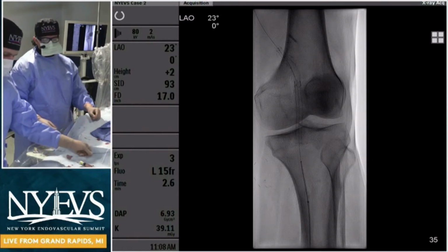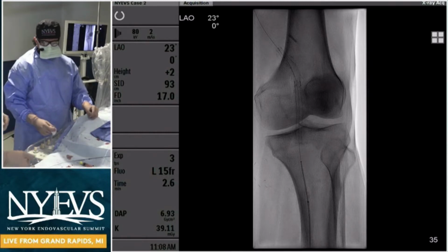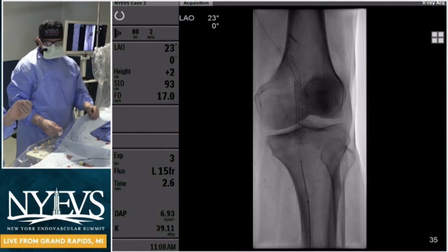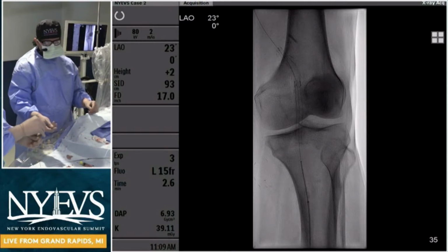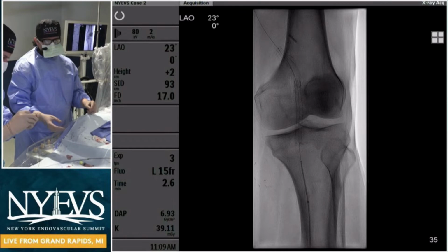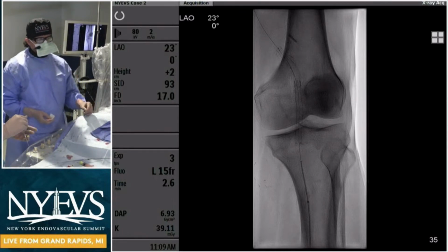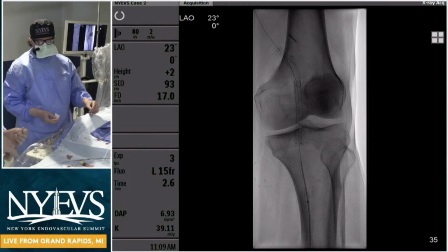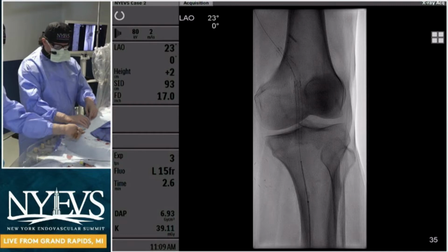Take the fifth, right? But when I was training, we were always taught that once a bypass graft is done, before I intervene on it, I'm going to change the natural history of that graft. If I put a stent in versus surgically repairing it, can you just expand on that a little bit? Because as an interventionalist, we're like, hey, I can go to the anastomosis, put a little stent in, and I'm done, versus you guys doing a surgical revision, maybe with a small cutdown, as Christian said. Does that still hold true?